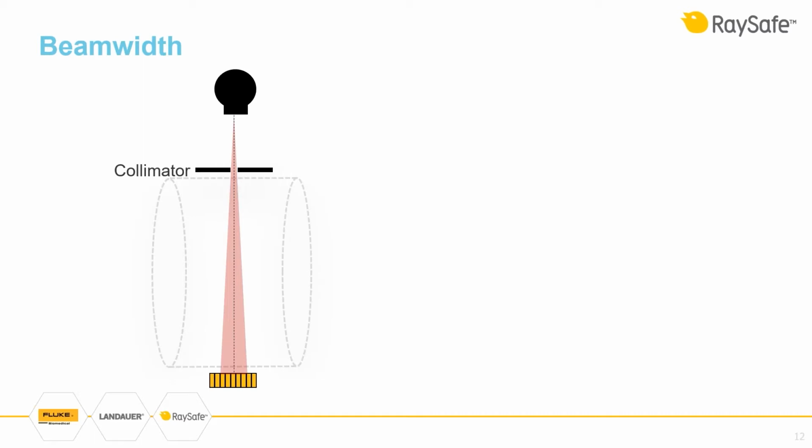If we look at the tube from the side, we can see the beam width, which varies from machine to machine and with which setting the machine is using. And the beam width is also defined at the ISO center. A CT machine can capture signals from many parallel channels simultaneously, and each channel is referred to as a slice.